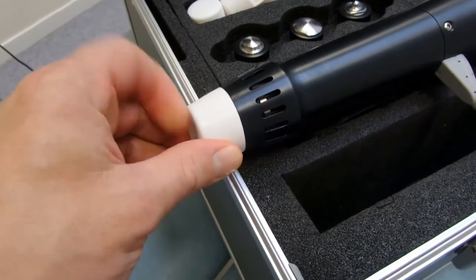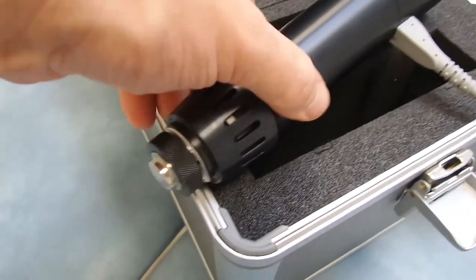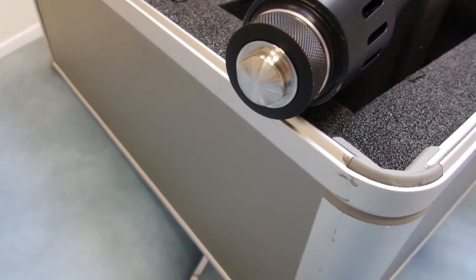Today we will be doing shockwave to the hand. We want to use the medium head on this machine. It's a 15mm head as you can see here.